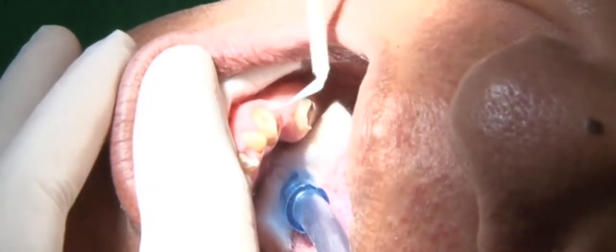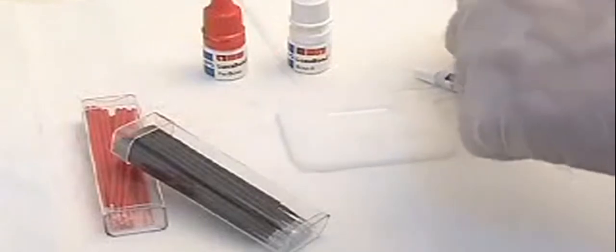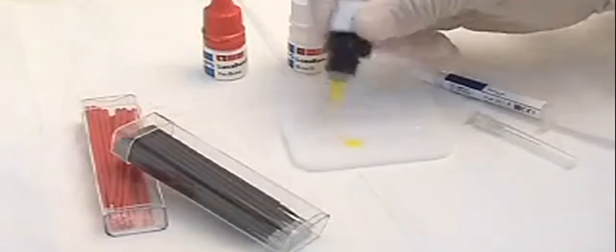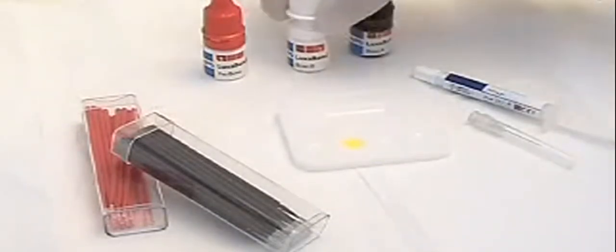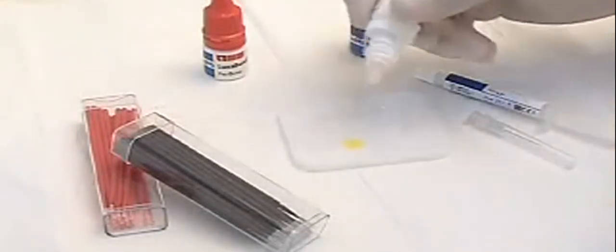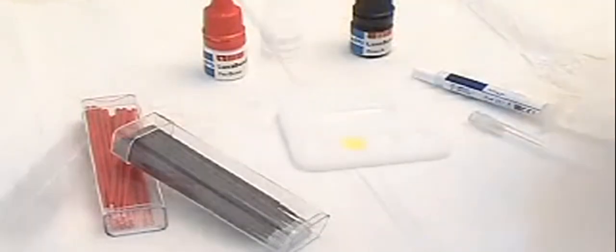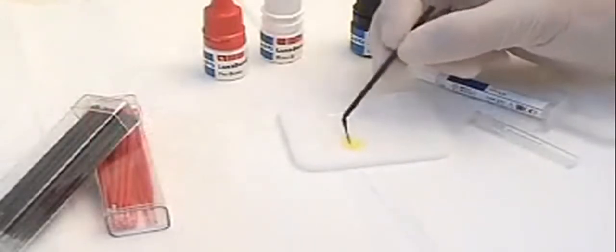One can use a thin applicator tip followed by a thin brush to ensure that the bond is applied meticulously in the post space. Now, mix 1 or 2 drops of bond A and bond B in 1:1 ratio for 5 seconds.